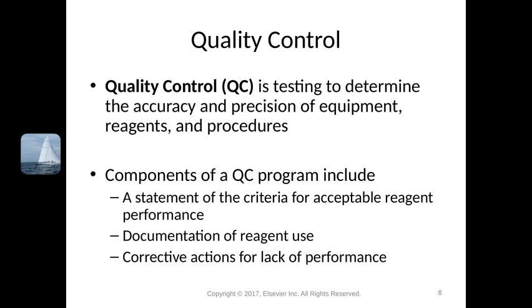But one of the things that we put into place is our QC, because our QC will tell us, yes, the reagents are performing the way they are supposed to. So I want you to take a look at, in the video section within the module, labeled videos. Take a look. I gave you a video on how you do QC, and that's how we do it at both the places I work at right now.